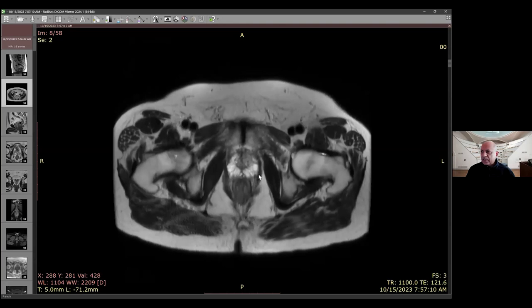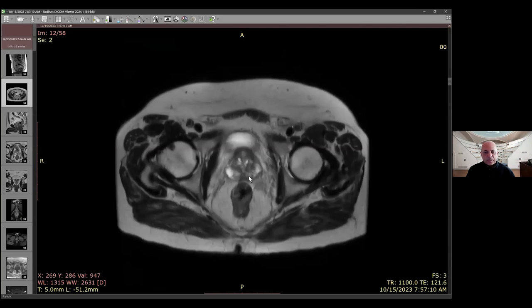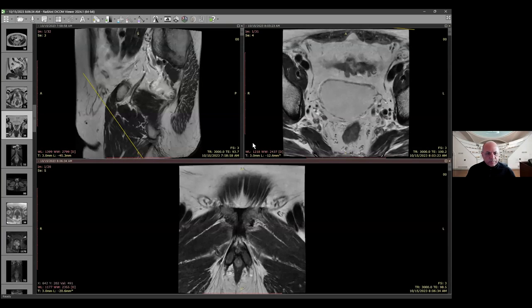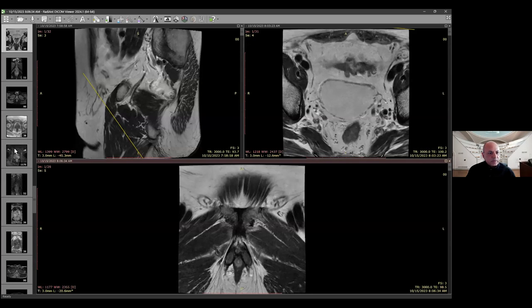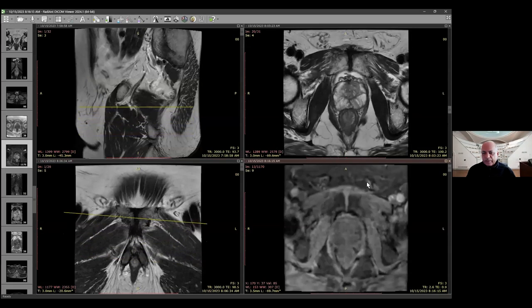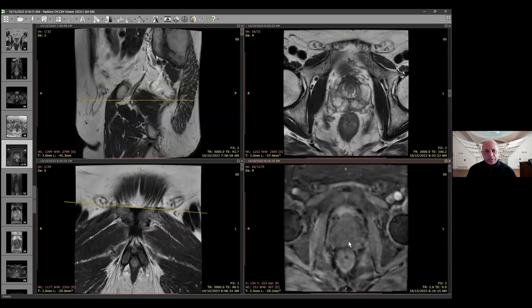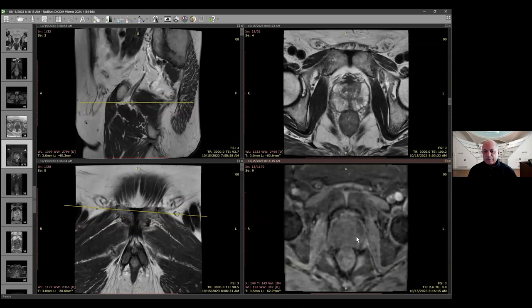Looking at this case, there is something arising from the bladder in the midline in the posterior superior aspect. Now let's look at the sagittal, axial, and coronal together. I bring up the triplane and also the T1 pre-contrast — I quickly take a look at the T1 pre and the goal is to make sure there is no hemorrhage. If you see anything T1-bright in the gland, the majority of patients now come before biopsy so hemorrhage is uncommon, but patients on anticoagulants can have spontaneous hemorrhage, and those areas can have relatively low signal intensity on T2.